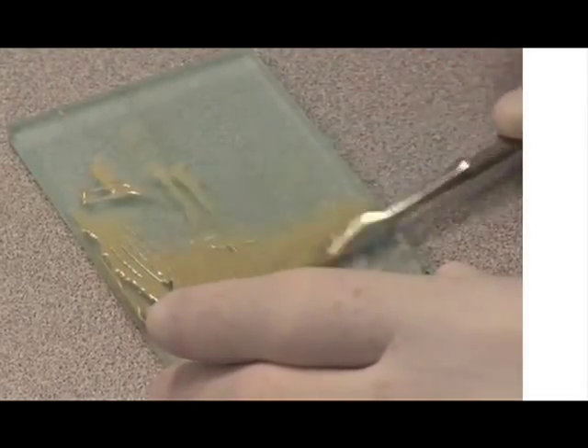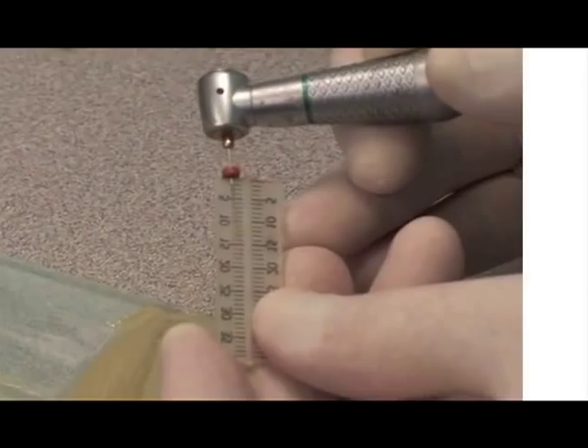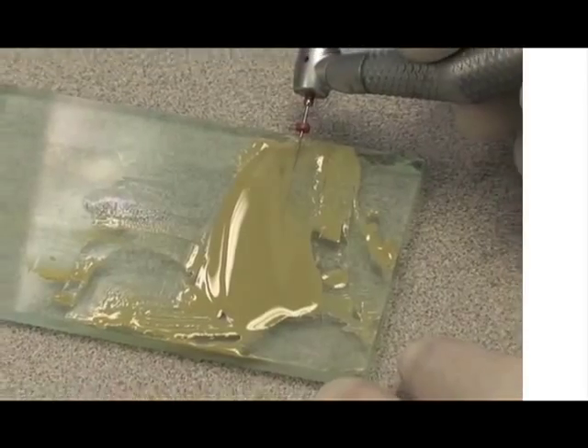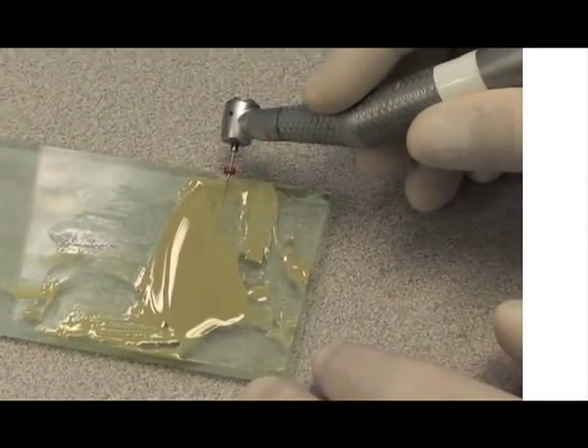Epoxy cements have a property where the application of minimal heat increases the flow significantly. Rather than use heat, I would simply apply more gel, but that would make the mix less radio opaque. Under any circumstances, the applied heat is minimal and the cement when applied to the canals is cooler than body temperature, meaning it will expand a small amount as it warms to body temperature.